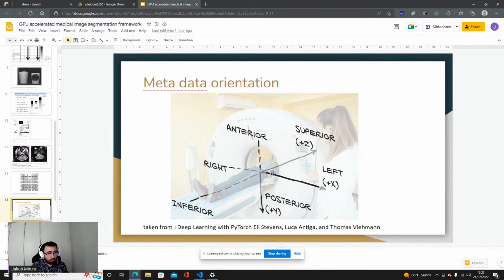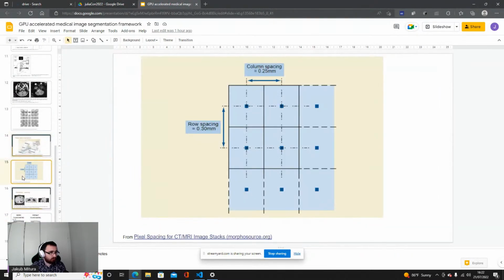So I would like to know later, for example when I see the MRI, whether the heart is, I don't know, 50 centimeters from the head or 40 centimeters from the head. We need to be able to retrieve such data. Because of it, we need to store metadata. One piece of metadata is the origin, so where we started, and the directions. Without this, basically we cannot interpret the image fully.